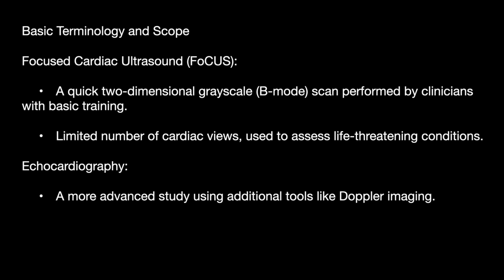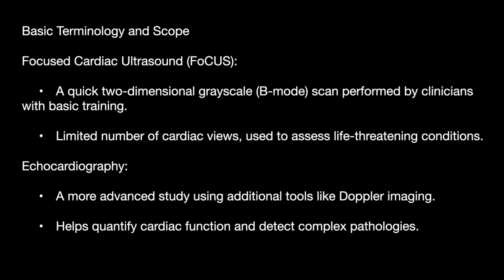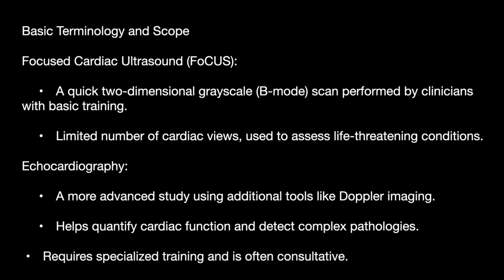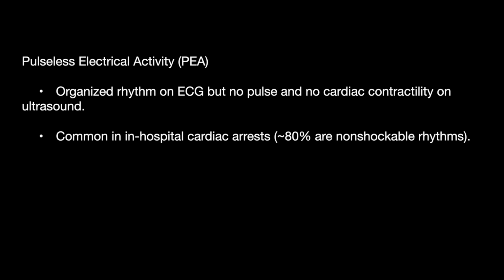Echocardiography is a more advanced study involving additional tools like Doppler imaging. It helps quantify cardiac function and detect complex pathologies. It requires specialized training and is often consultative. So there are two conditions: pulseless electrical activity and pseudo-pulseless electrical activity. In pulseless electrical activity, you will find an organized rhythm on ECG but no pulse, with no cardiac contractility on ultrasound.